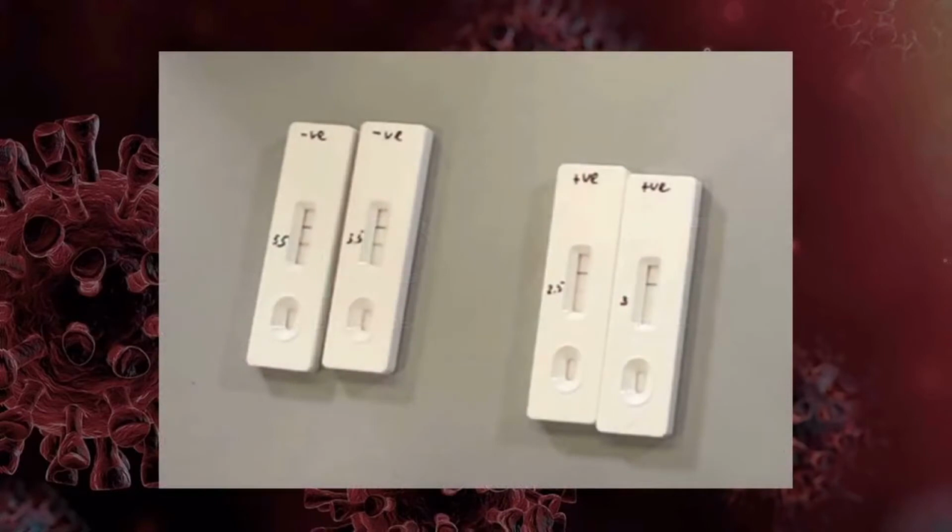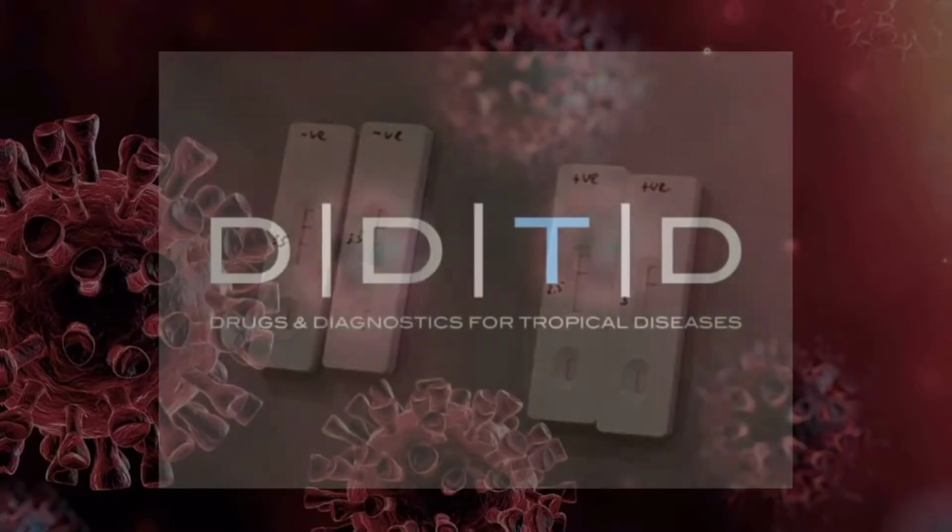This means that the assay produces a strong test line in the absence of mycolactones and a weaker test line in the presence of mycolactones. The fact that this test line disappears in the presence of mycolactones may be counterintuitive, but is correct.